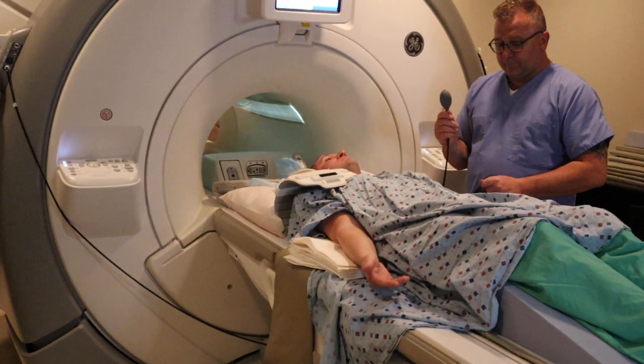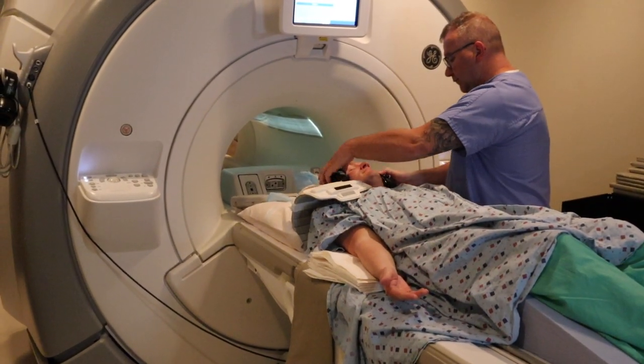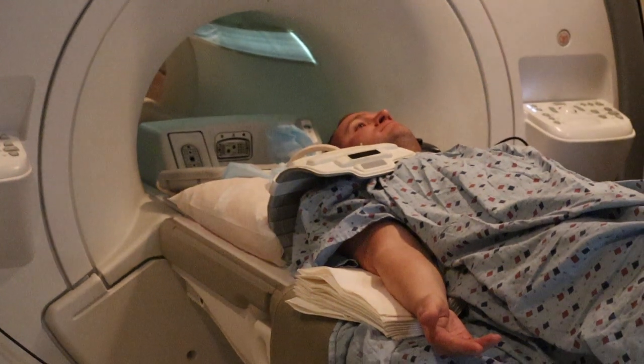You want to provide the patient with the emergency ball in the opposite hand. You want to provide headphones for communication or music. And you're going to landmark at the coracoid process of the shoulder.